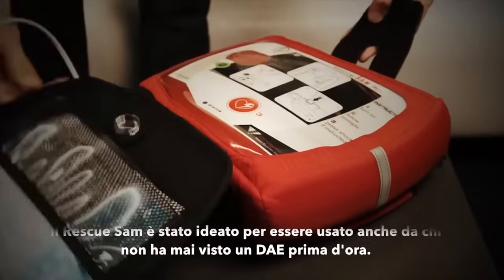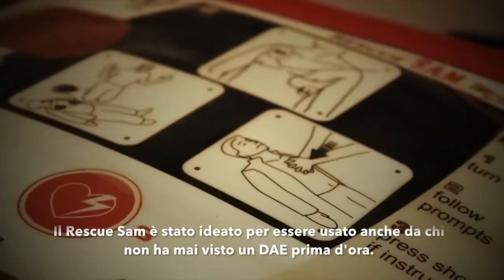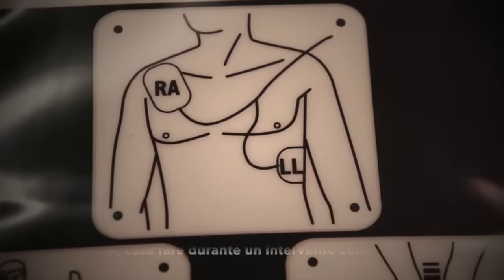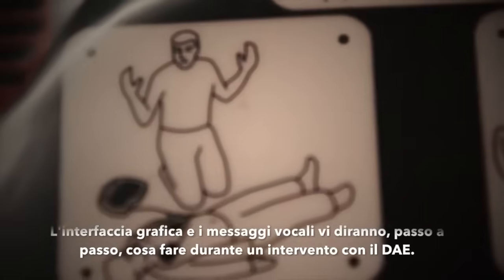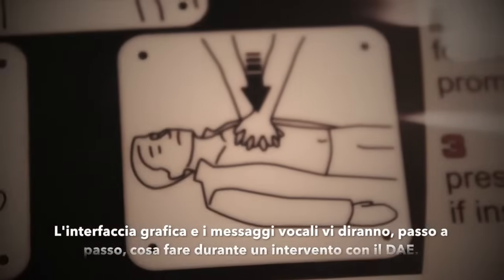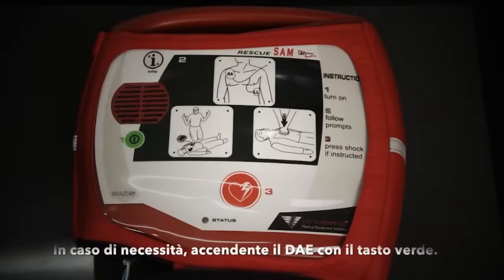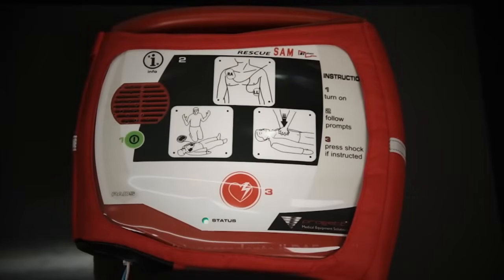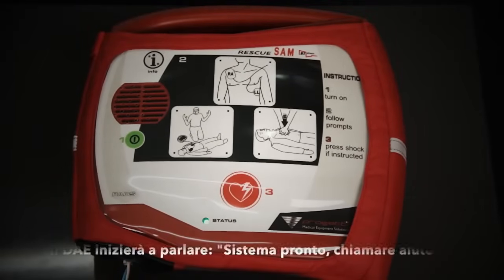The Rescue Sam is designed to be used by anybody, even those with no experience in resuscitation. The main interface has graphics to show how the pads are applied to a person and how to perform CPR, with loud and clear voice prompts. Pressing the green power button will start up the defibrillator. Listen to the voice prompts and follow the instructions.